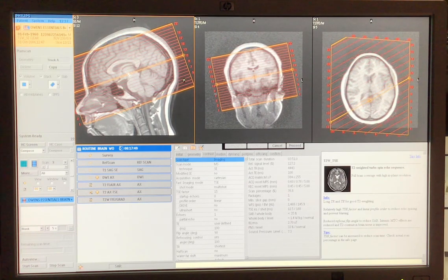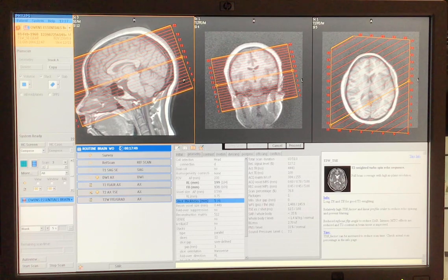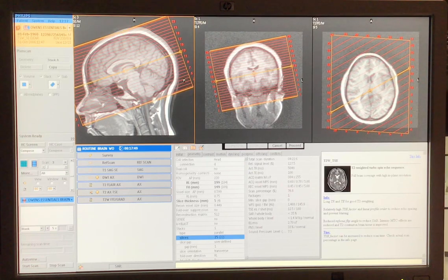that I need more slices because again, I want to be starting out in my foramen magnum, and I'm actually not all the way through to my vertex. I'm not even to the skin, am I? So just go to your geometry and add some more slices. Maybe let's add 3 slices. And then I'm going to go ahead and position it. I'm into my foramen magnum. I've also got all the way through into my skin.